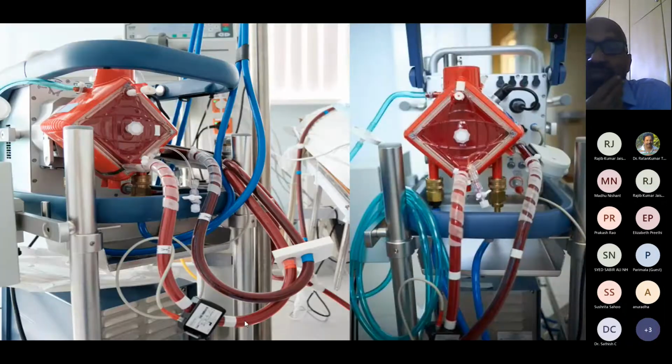And if we talk about ECMO, it is a very complicated invasive technique to support the failing heart or failing lungs or both by using extracorporeal devices.